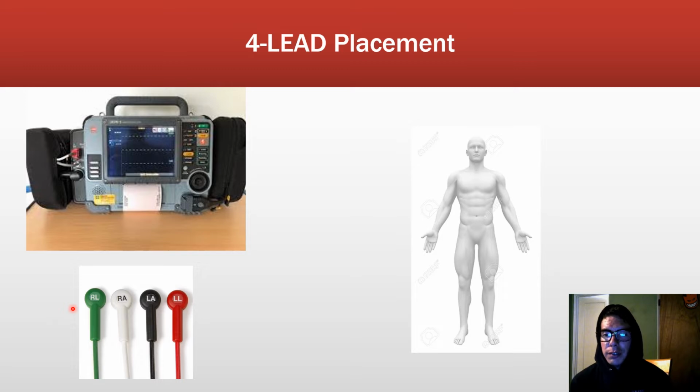Just for the sake of, I guess, patient dignity, you probably shouldn't do that. But we generally just put it on the left leg or the left leg's area, based on what is considered a left leg, because like I said, it can be a pretty big area that you put it on that's not exactly on the limbs, but it's called that, and you usually do put it there.